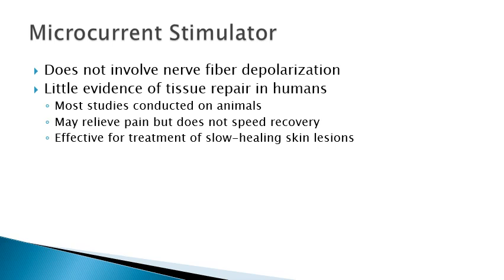Again, some of the research on microcurrent is just kind of getting looked through. It has, however, been shown to show some effects. So I'm not going to say it's not a good waveform to use. It's just that it's still kind of being looked into as far as some of the effects that it has, unlike some of the other waveforms that we previously discussed.